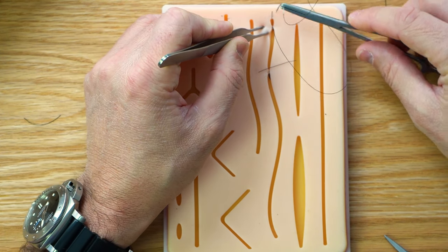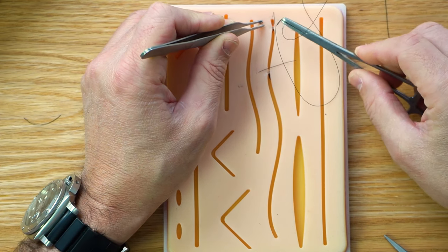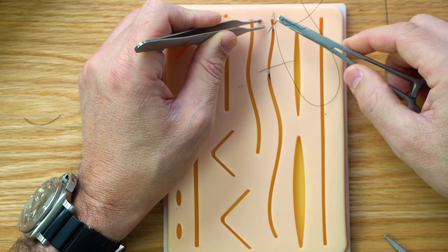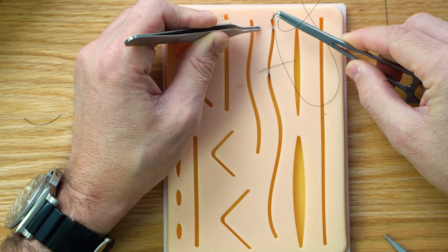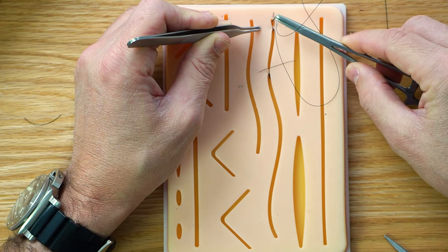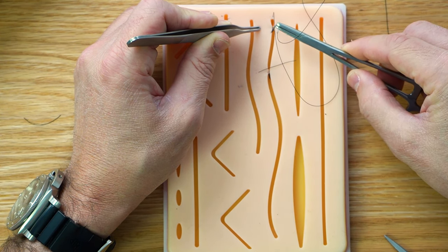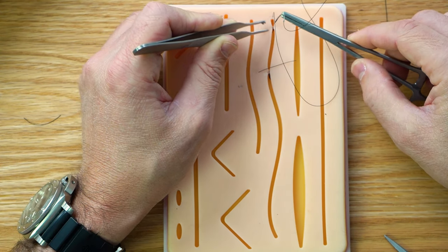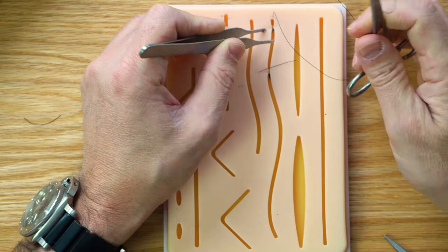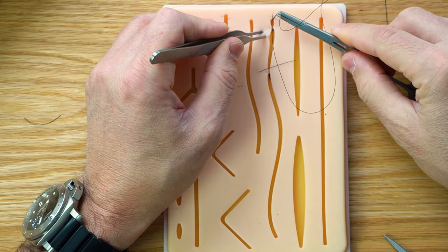Now this is the thing that a lot of people wanna know how to do. And I see a lot of students try to arc the needle around like this, and it's essentially what you want to do. You want the needle to go in here, like down here, and then you want the suture to come this way, and then you're gonna make like an S, and it's gonna go like this, okay? But there's a lot of different ways to do it. You don't have to have the suture going in like this way, right? You can have it going this way.